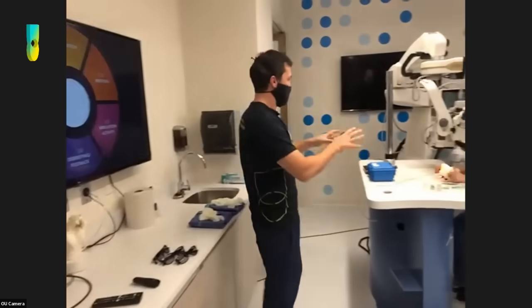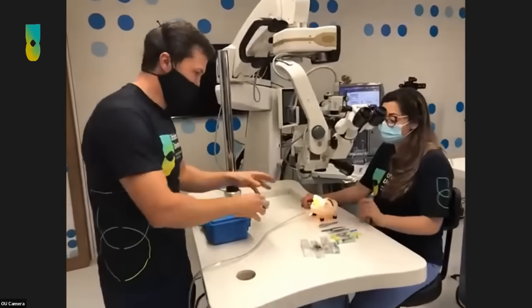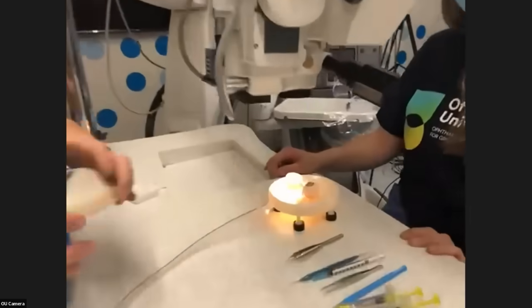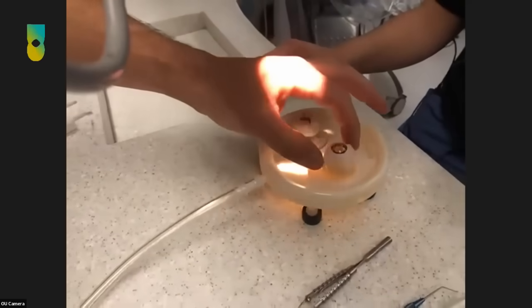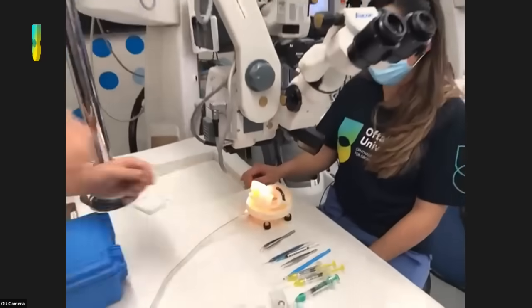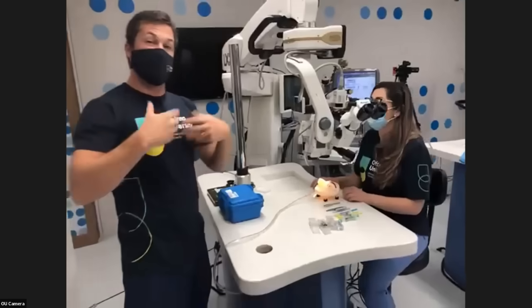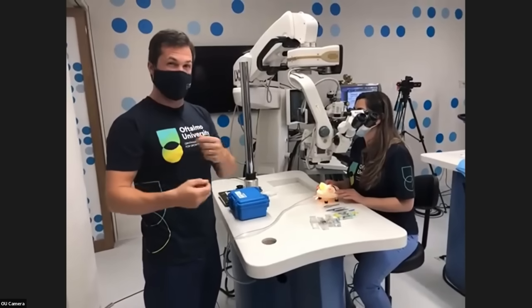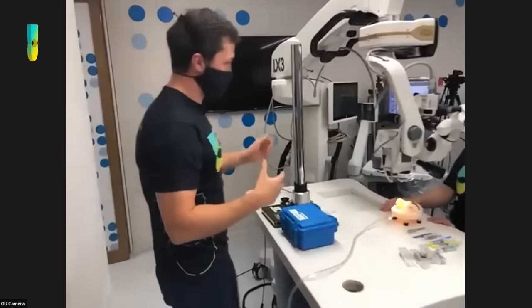On this side, we have a bionic setting with 2 artificial eyes. And if you come close, one of the important things is we're going to do capsulorhexis. And look at this. This is going to be a fixed model, and this is going to be a moving model. So the skills are going to be a lot harder in the moving eye. So what we're going to do is have an incremental experience. It's going to be harder and harder, but that's good because it allows us to teach some skills better.